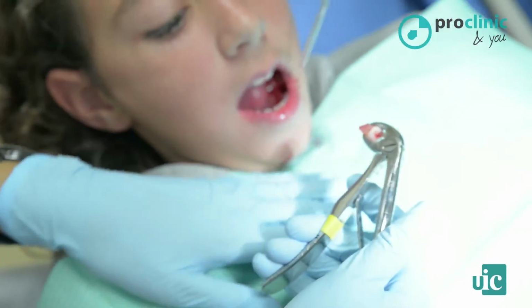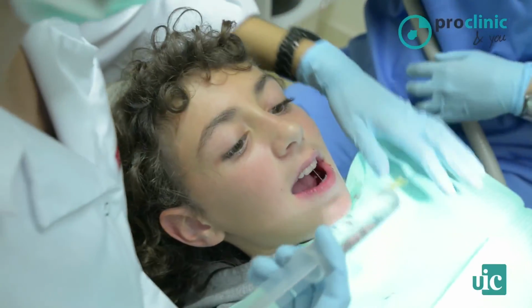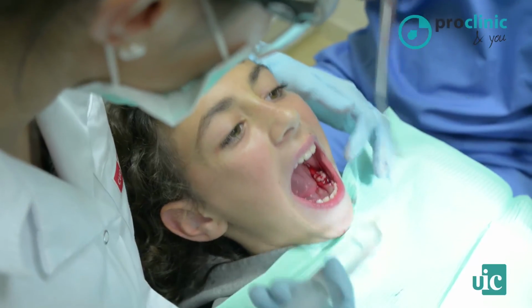That's all. We have done it so fast. Great. Now we can clean the socket with saline solution.